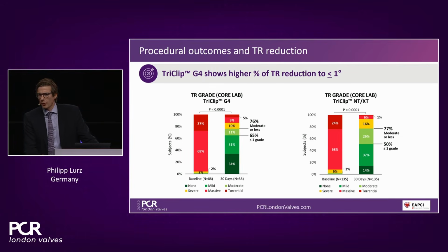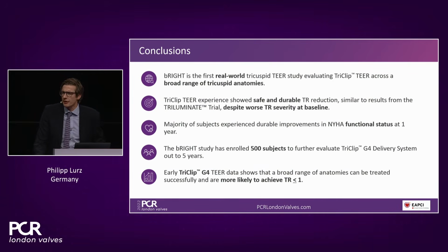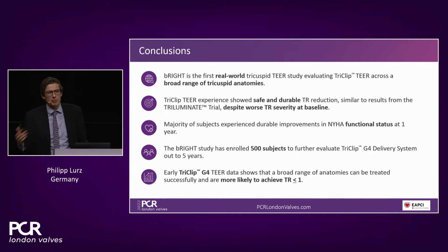So again, quite encouraging. In conclusion, bRIGHT adds to the field some real-world data. We see that many patients seem to present quite late. We treat in the vast majority massive or torrential TR, but yet we get good outcome. We see a quite robust and strong signal in terms of symptomatic improvement, and with G4 we treat quite complex anatomy. Thank you.